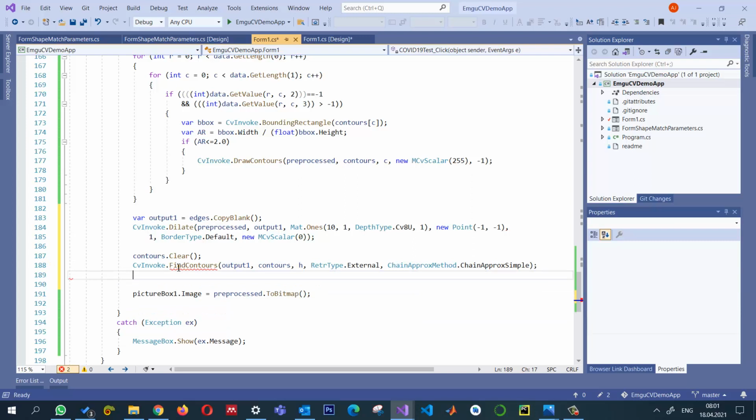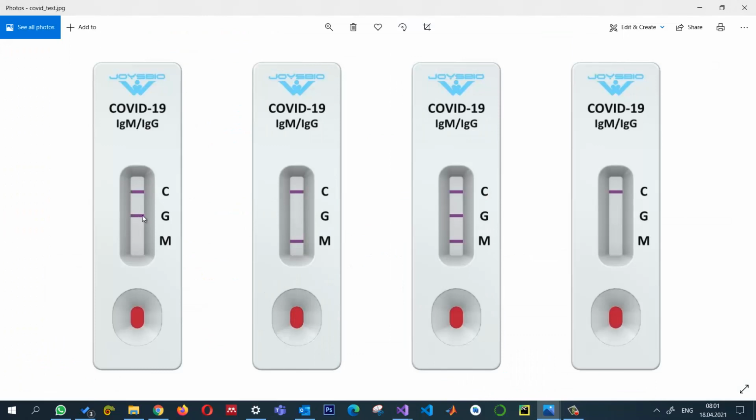So once I have these contours, I can now loop through those contours and eliminate the contours which are not in the middle or the longest ones. The ones which are not these contours have some small width or height, and then we can remove them quite easily. So one thing that we can see is that for the middle one, the height is at least 2 to 3 times greater than the width. So I can write a condition: if the height and the aspect ratio is 3 times greater than the width, then we can consider that as our result strip.